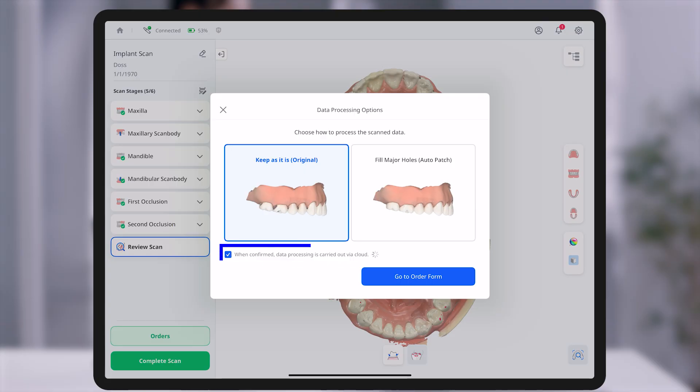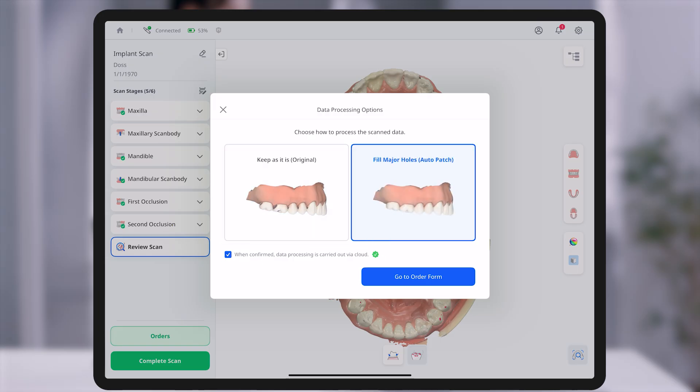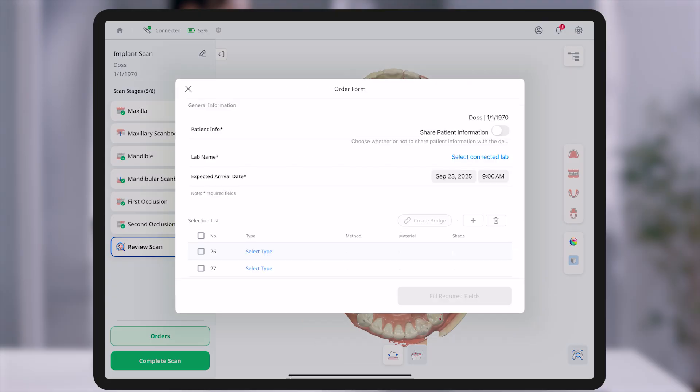Additionally, if you select the checkbox below, the scan data will be processed in the cloud and the finalized result file will be automatically downloaded to your device. The original data stored in the cloud will not count toward your cloud storage usage.